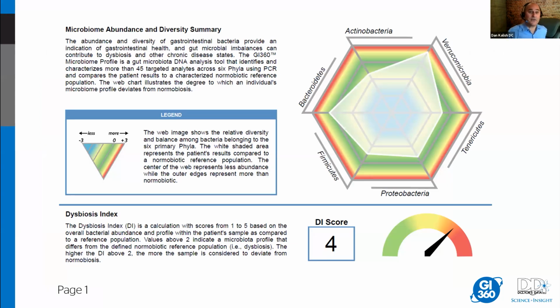So you really have a bunch of choices there, okay? And now let's look again at a couple other examples here. So you can see here the dysbiosis index, and there's a score there. And all the labs are always classified like this, like red is bad, green is good. So you can see the dysbiosis index. This is a super helpful and very important thing.